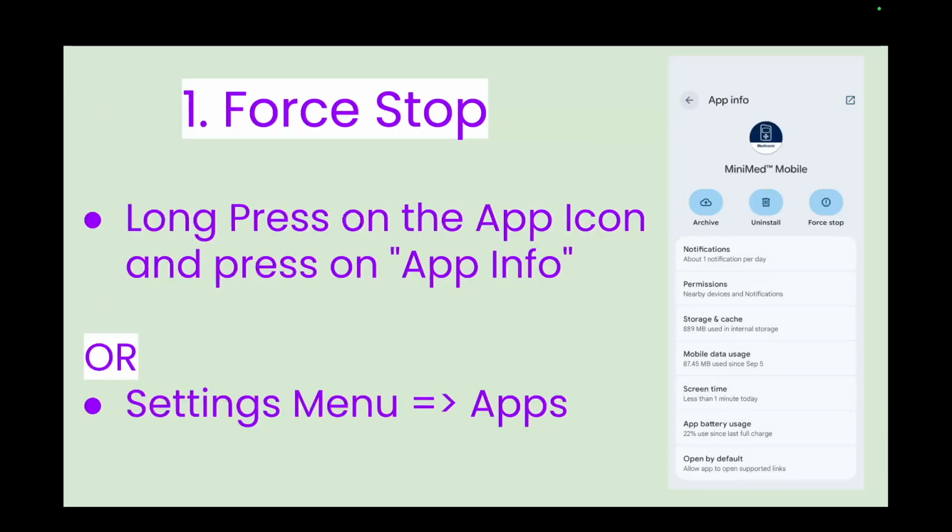Number one, I force stop. I make sure I shut down that MiniMed mobile app. On Android, you can long press on the app icon and press on app info, or you can go to the settings menu and then apps. Once you find the screen, open it up. It says app info and click on force stop.